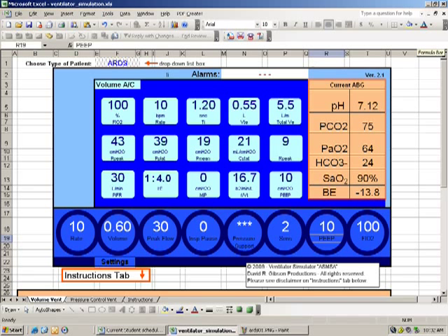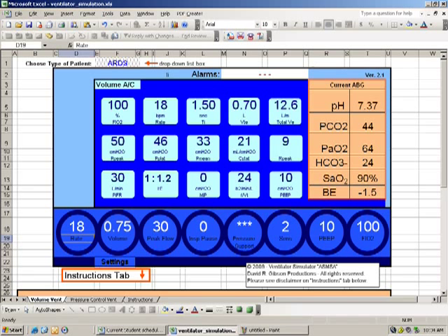And of course, the problem that we have next is if we were to get a blood gas, to see that our pH is only 7.12. We have a significant respiratory acidosis with a CO2 to 75. Of course, this has to be brought down. And if you've seen my video on ABG and CO2, then you know what to do. Increase the minute ventilation. These smart students knew that and increased the rate to 18, giving us a minute ventilation of 12.6 and success. We have a pCO2 of 44, pH of 7.37, and an oxygen that's barely in range. We'll probably have to do something with that later. But for right now, they felt pretty good about themselves.